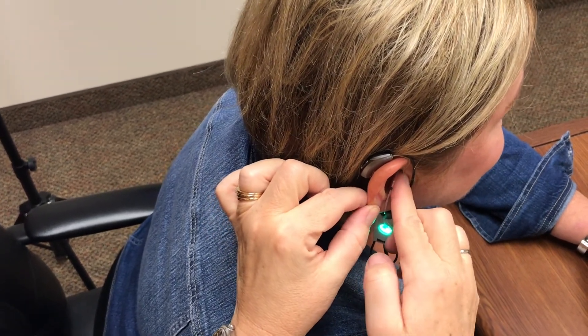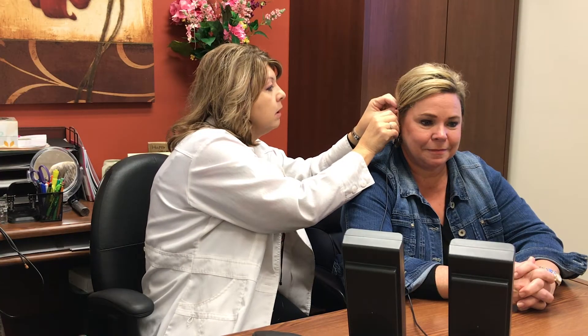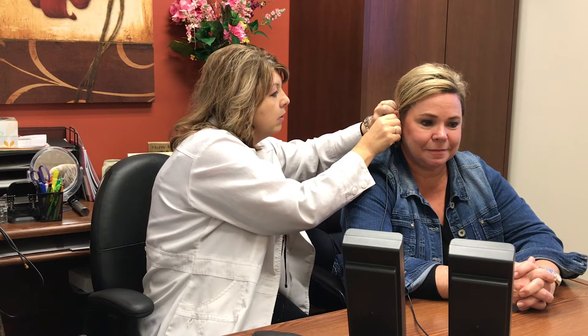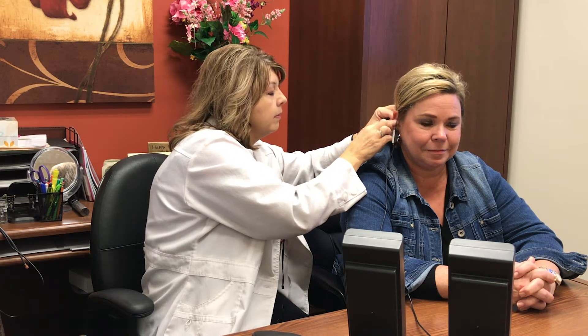Then we're going to go ahead and put in a hearing aid that's already been pre-programmed for the hearing loss. After that, we're going to run another test which is just some static and a spoken passage. Again, you don't have to do a thing.